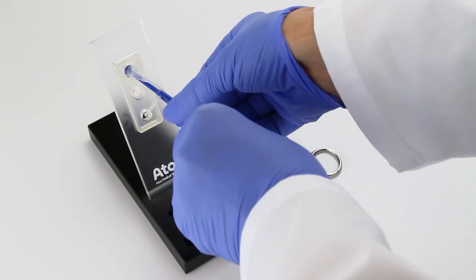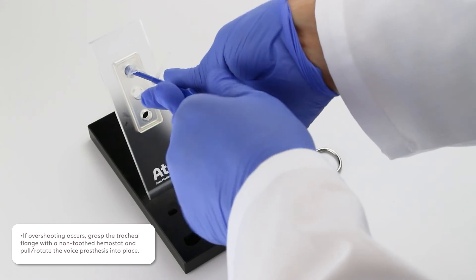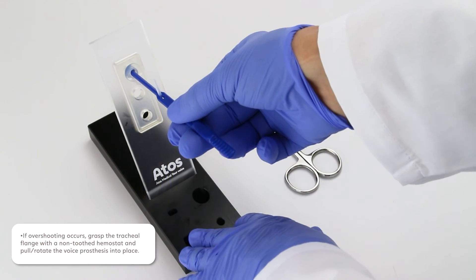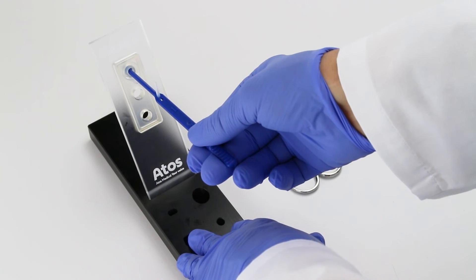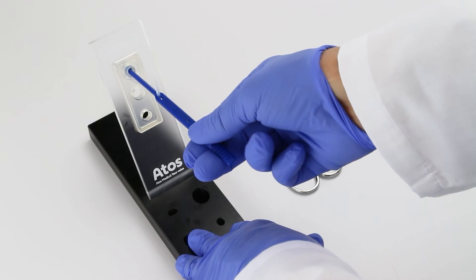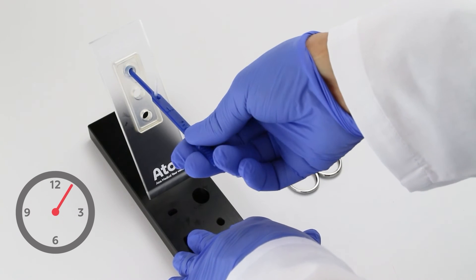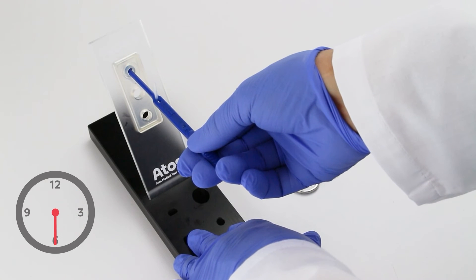Check for proper positioning by rotating the prosthesis to ensure it is spinning freely. Then lightly pull on the pin to confirm the prosthesis is securely in place. Once placement is confirmed, but prior to cutting the safety strap, rotate the voice prosthesis so the safety strap is pointing downwards in the 6 o'clock position.